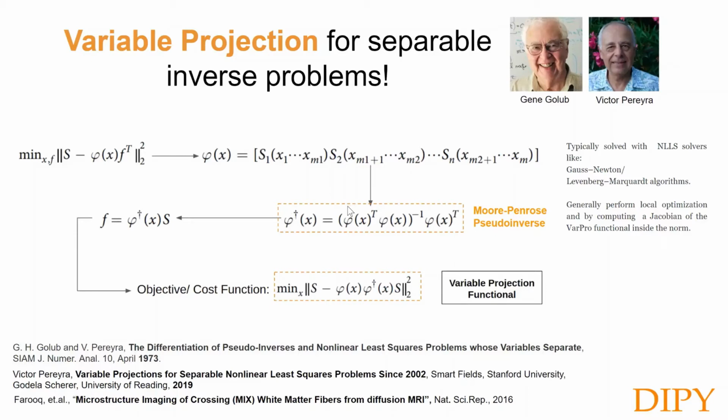So this is a very nice trick. The general alternative to doing this is using Gauss-Newton type of optimization, like Levenberg-Marquardt algorithms. What that does is basically compute a local Jacobian, and that Jacobian tells you which direction to go into, like is often done in SGD.